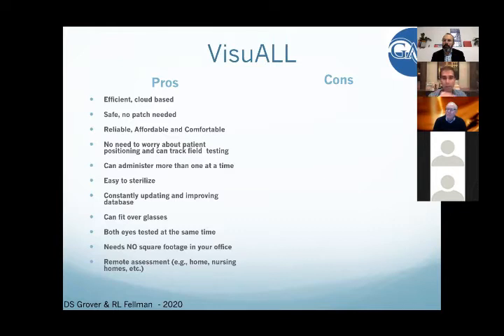And here, the patients can sit in the position they want, at the location where they find it best. And then there's this potential again for home monitoring or outside the office monitoring, which I think a lot of things are moving towards, given the challenges the pandemic has placed on us.